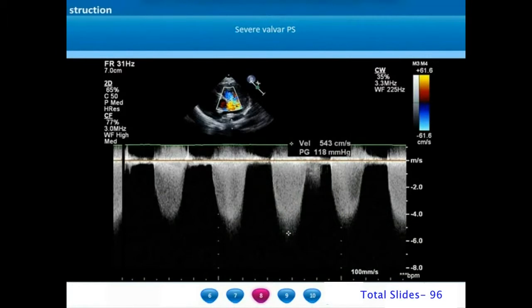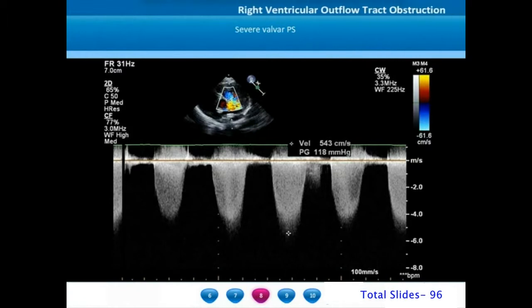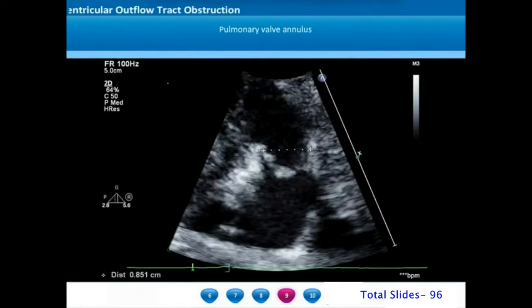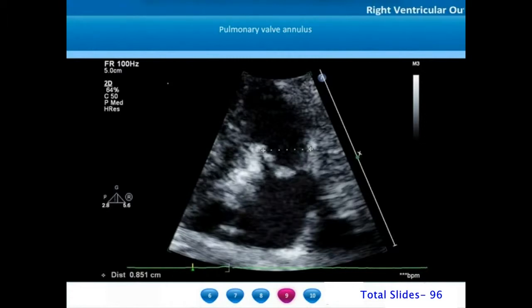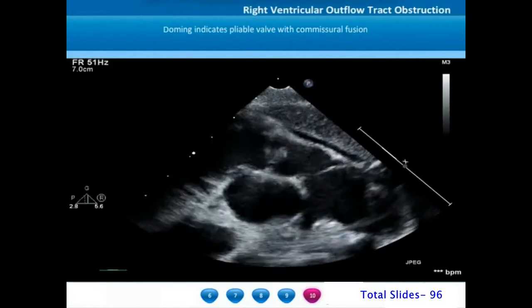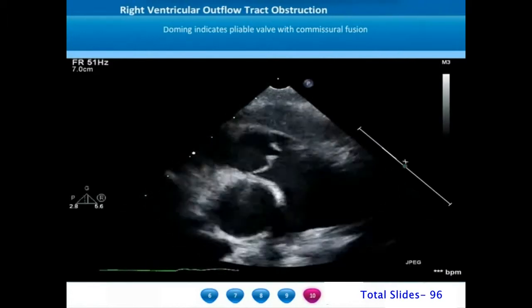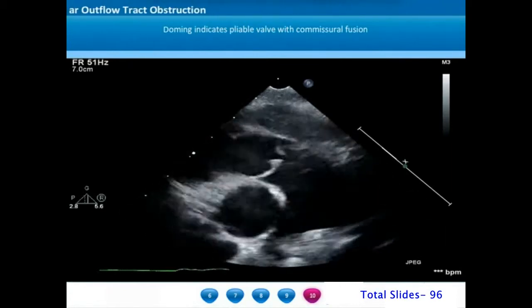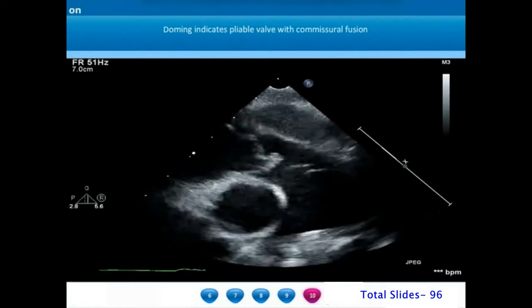Using spectral Doppler interrogation we can assess the severity of pulmonary stenosis. Here we have a pulmonary stenosis gradient exceeding 100 mm of mercury, which qualifies as severe valvar pulmonary stenosis. On a frozen systolic frame of the long axis of the outflow tract, we can measure the pulmonary annulus from the hinge points of the pulmonary valve. The doming of the pulmonary valve indicates the valve leaflets are pliable and the mechanism of stenosis is due to commissural fusion.